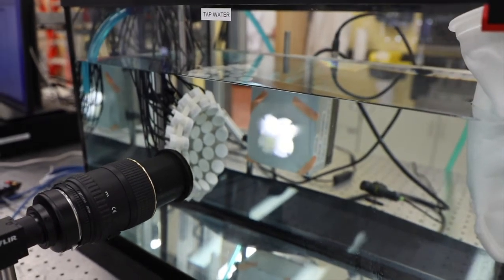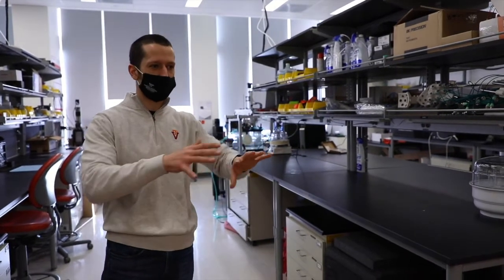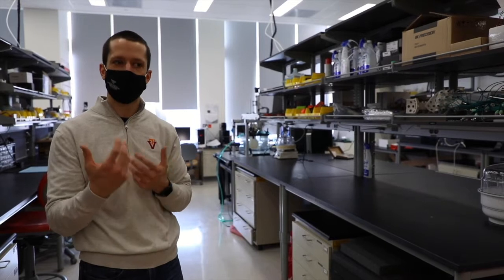Let me shut it down now, I think. And that's what's going to be destroying the tumors when we treat. So that's most of our lab. You can see this is our benchtop setup. We use a lot of these optical tables and high-speed cameras or ultrasound imaging feedback.